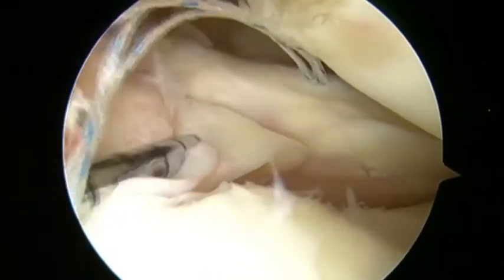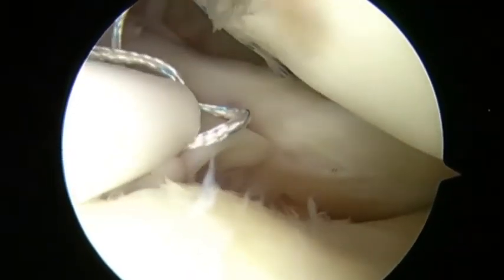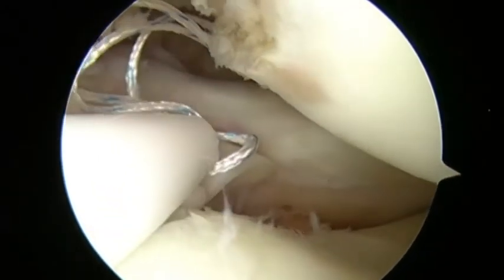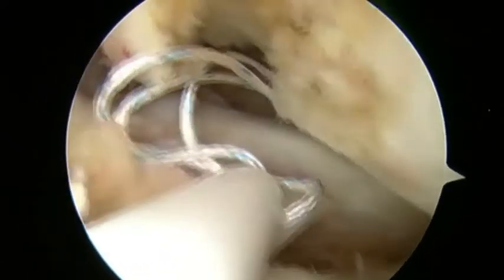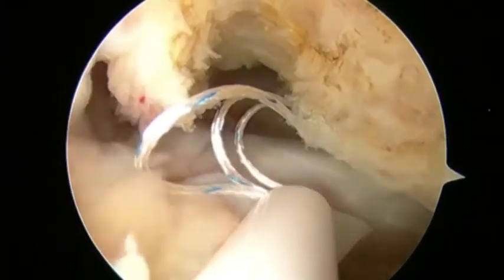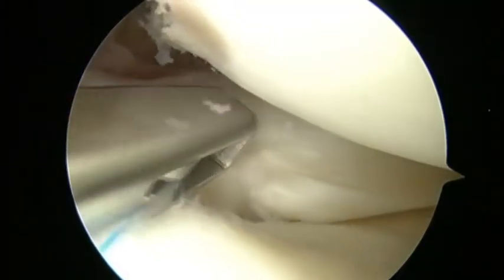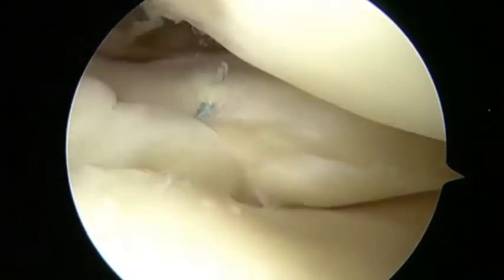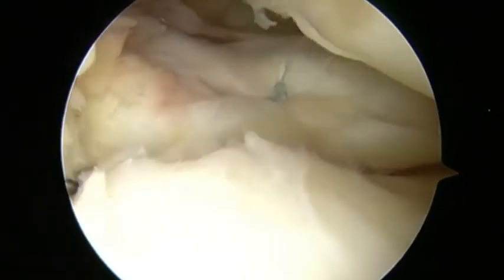The meniscus repair device is introduced from the medial portal guided by a slotted cannula. The depth limiter for the device is set at 20mm because the entry point for the first side-to-side stitch in the meniscus root is central. For a peripheral entry point in the red-red zone, we set the depth limiter to 16mm.